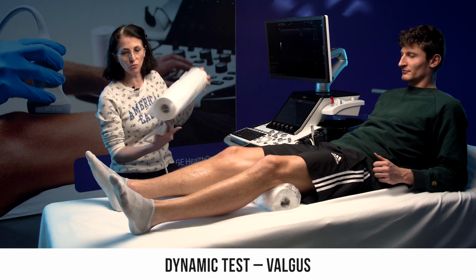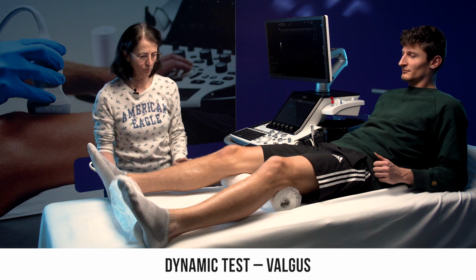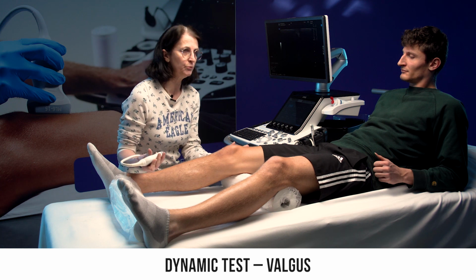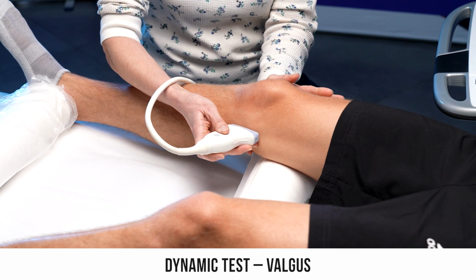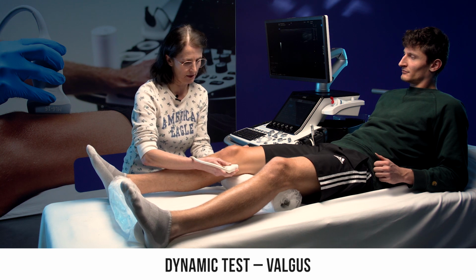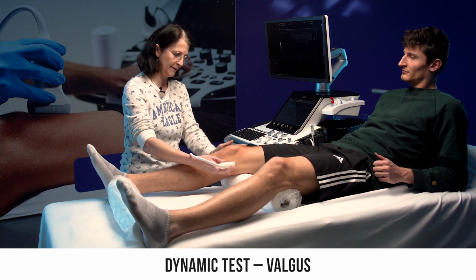We then place a second bolster between the patient's legs to wedge the two feet apart like this, which provides some counter pressure. With my free hand, I press on the lateral side of the knee and analyze the collateral ligament on a coronal view as usual. The patient will need to counter my pressure by pressing firmly with the other foot.